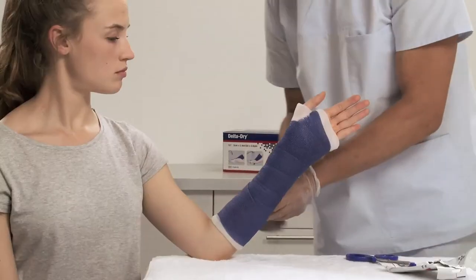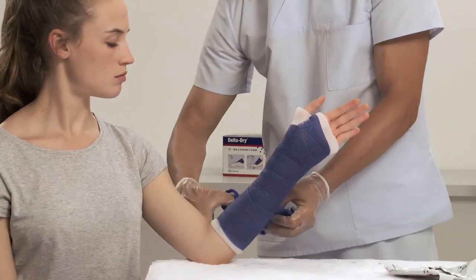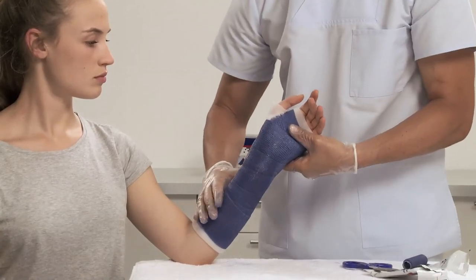Mold the cast with the palm of your hands and check the desired range of motion and any points that may cause irritation or pressure points.